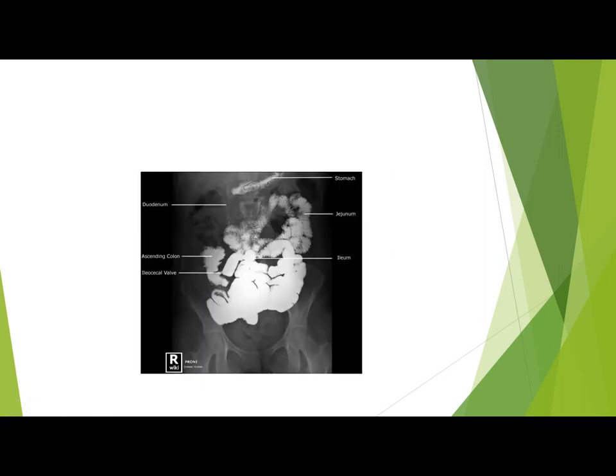This is in case of the barium imaging. I think this is a follow through. You see, the stomach is also seen. Here is the area of the ileocecal valve.